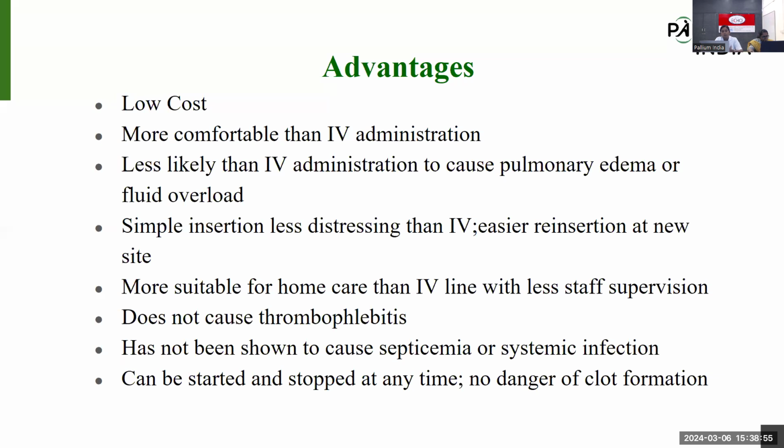It is very clear we are not touching any IV line. So it is less distressing than IV, easy to reinsert, and more suitable for home care than an IV line, with less staff supervision. If a patient is with an IV line, there is a chance of bleeding, clot formation, and thrombophlebitis and all. Here there is less chance of these complications, and we can teach the caregiver how to insert a subcutaneous line. So it is easier and suitable for home care patients.